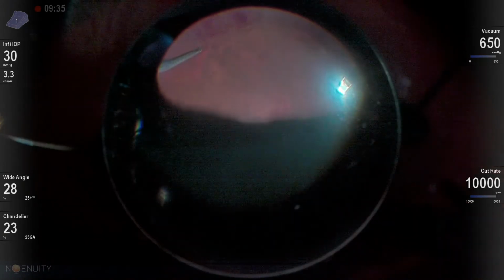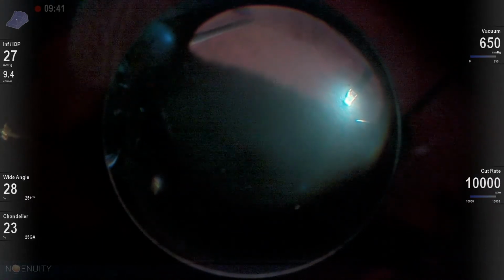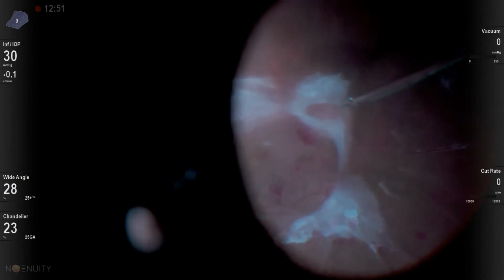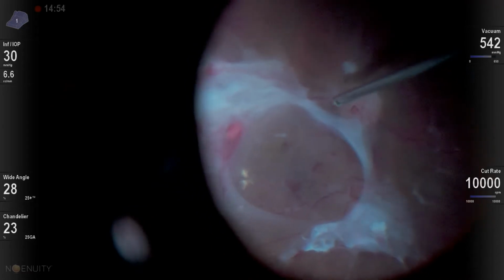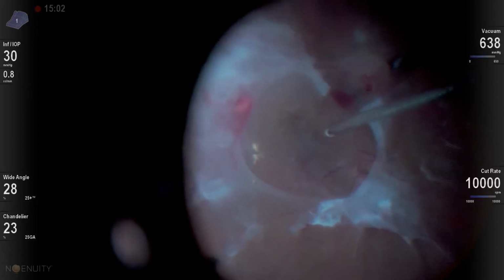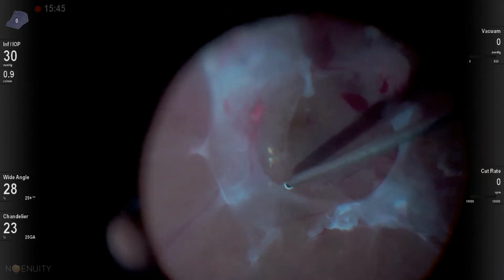In this situation, the mid-peripheral vitreous was up, and so I like to just get in and get my bearings by doing peripheral vitrectomy here, clearing out the hemorrhage. And once I've got that cleared out, then I start out working on my segmentation. Now, what I'll use first here are some max grip forceps, and I just go for the easy target, picking up some of the fibrotic neovascular tissue. Patient's been treated with anti-VEGF about a week or two before, and elevating and creating a plane.